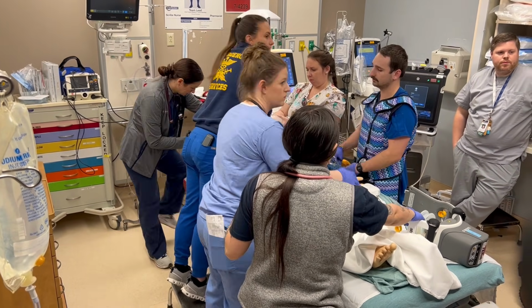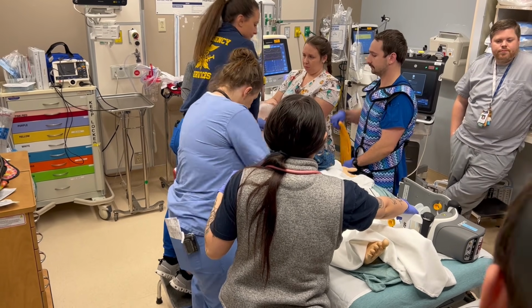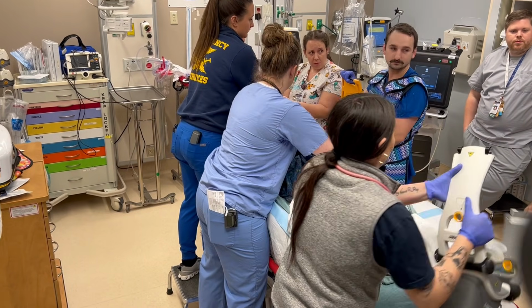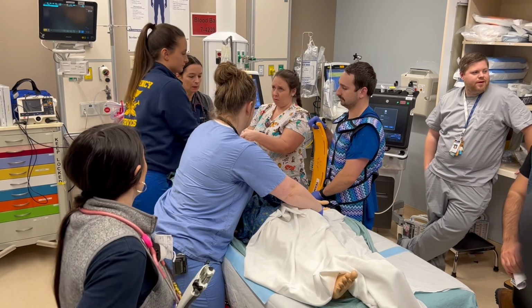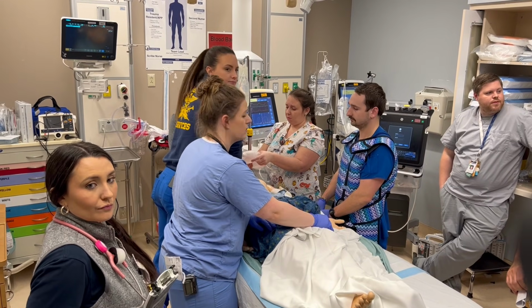Are we ready for the transport? Are we ready for the Lucas? Okay, just to make it easier, continue. All right, transport. I'm good. I'll take over from here for the CPR and for the transport. Are you okay with the Lucas and the transport? Yeah. We're just switching methods. I have one more minute and then a full pulse check.